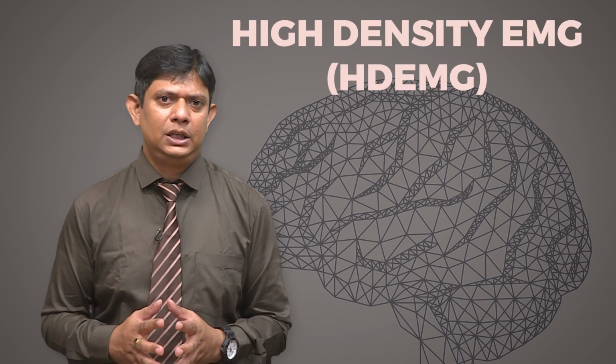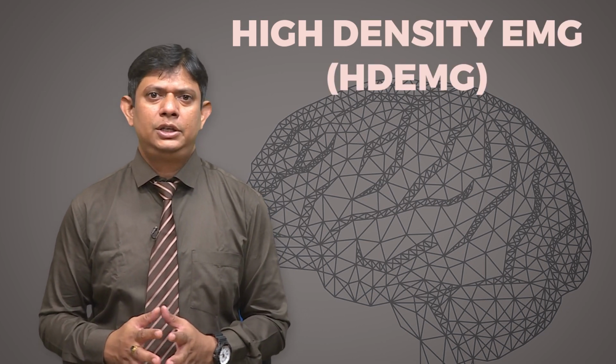Now, let us talk about the high density EMG, abbreviated as HDEMG. It is a non-invasive technique to measure electrical muscle activity with multiple, more than two, closely but evenly spaced electrodes overlaying a restricted area of the skin.